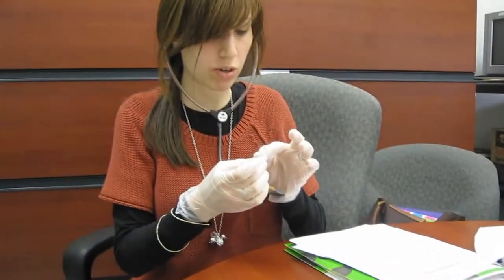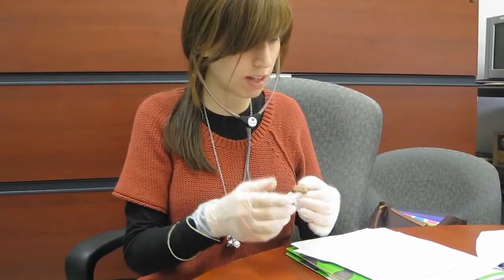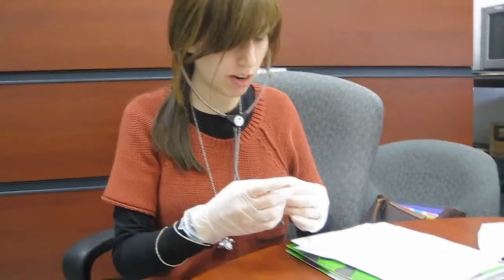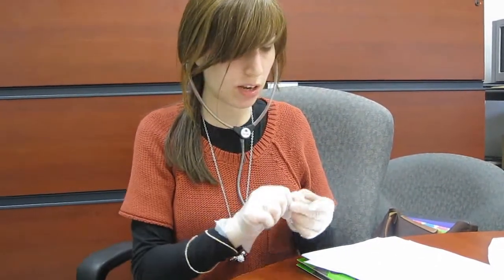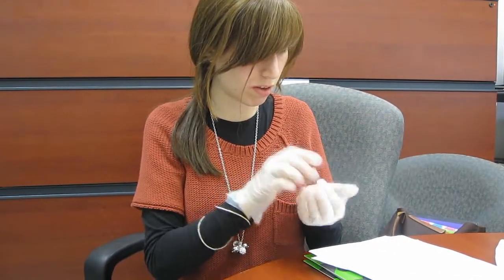Now we want to just make sure that as the volume control gets louder, we hear things. There is some feedback here, but I hear everything good. As the volume gets louder, I hear it louder. And then we're going to take it off and just check the feedback when it is cupped in my hand. And I hear it. Okay.